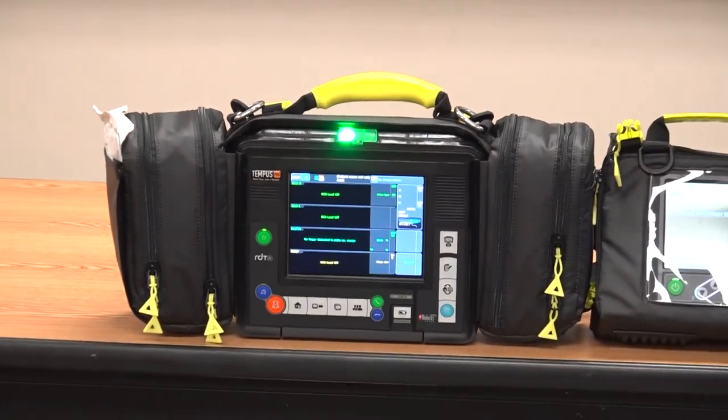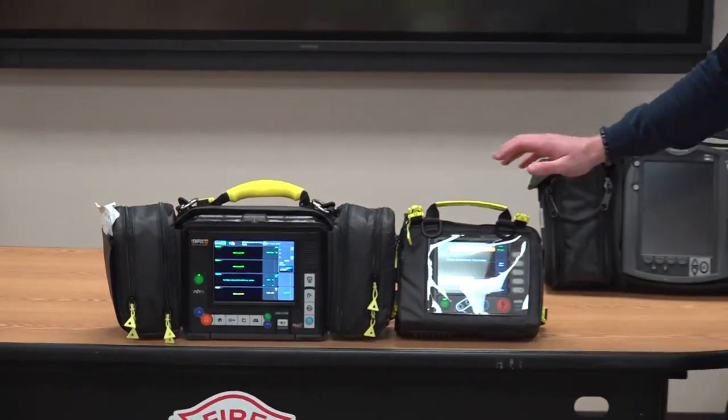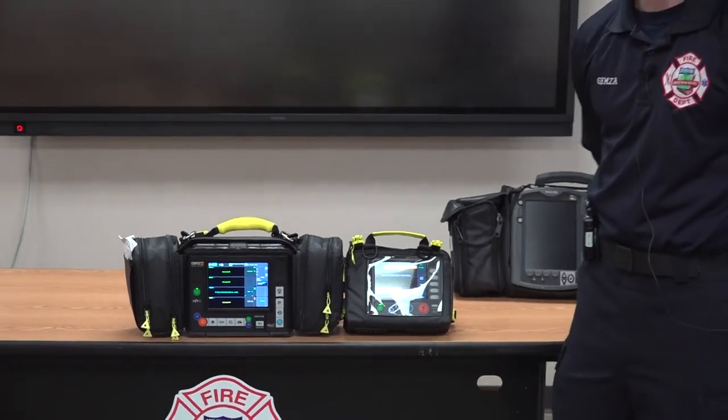As you heard that little chime, that is the monitor syncing up with the defibrillator. The two of them communicate by Bluetooth.